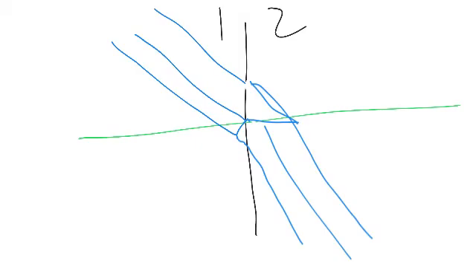With transmission, it depends on several things. It depends, one, is there a difference in speed of the media? If there's no difference, then it just goes straight. Okay. Second thing it depends on, is media 1 faster or slower than media 2? Okay. If there is a difference in speed and there's a difference in angle, an oblique incidence, then we get refraction.